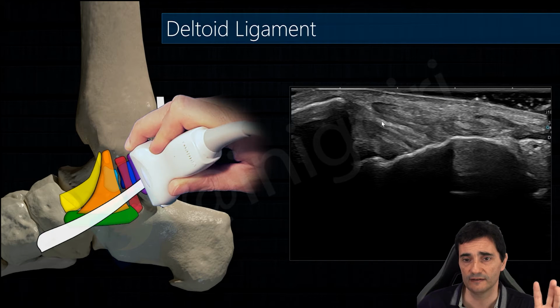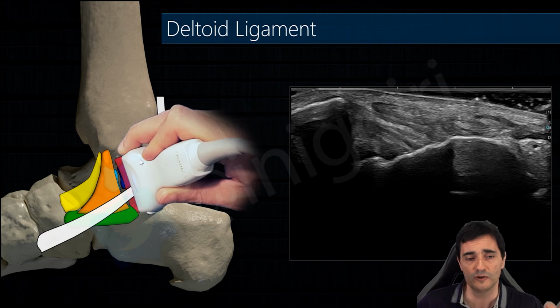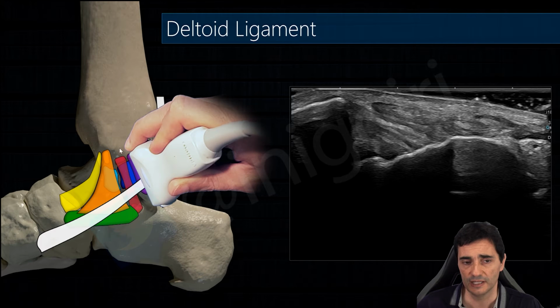You can notice here a better view of the pattern of the ligament with this tiger-like shape inside the posterior tibiotalar ligament, and a better differentiation between the superficial layer and the deep one. Okay. Now we are moving anteriorly, and the next component will be the tibiocalcaneal ligament from the tibia to the sustentaculum tali.